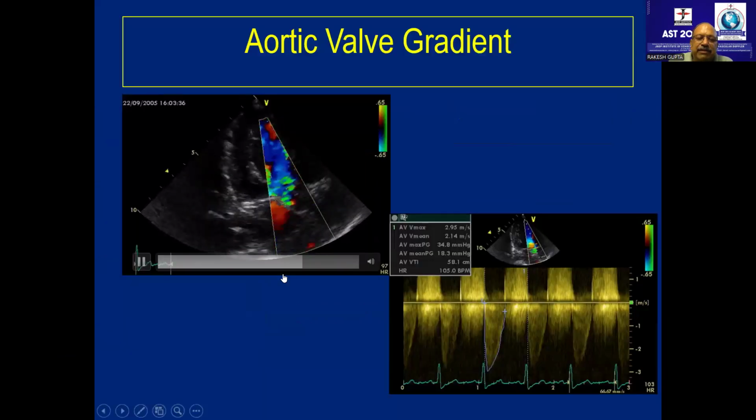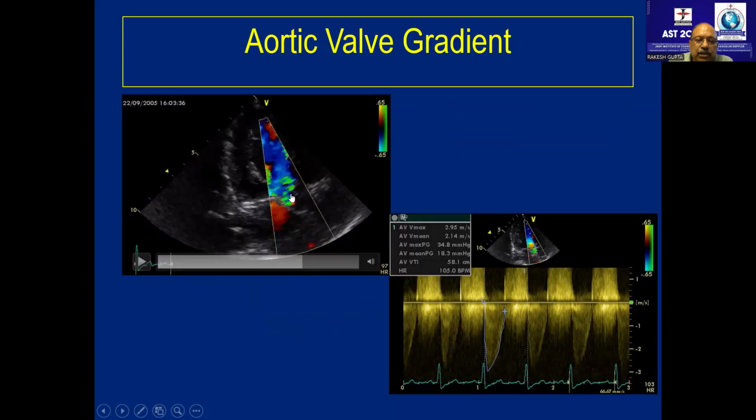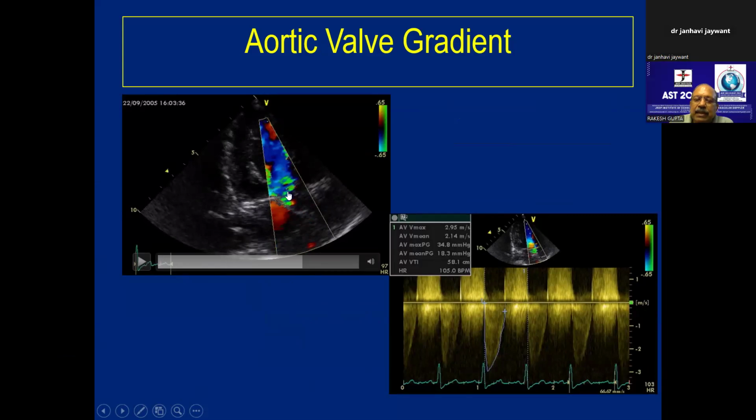Now, can you see this three-chamber view? Yes, sir. So let me just freeze this image. So this is LA, this is LV, this is aorta, correct? And here are the aortic valve leaflets. Clear? If I put my pulse wave sample volume over here, it will be a pulse wave LVOT. If I take this sample volume distal to the aortic valve, it will be pulse wave at the aortic valve.